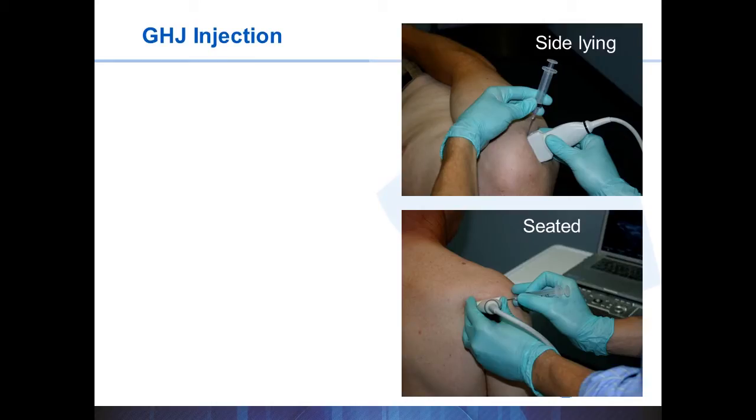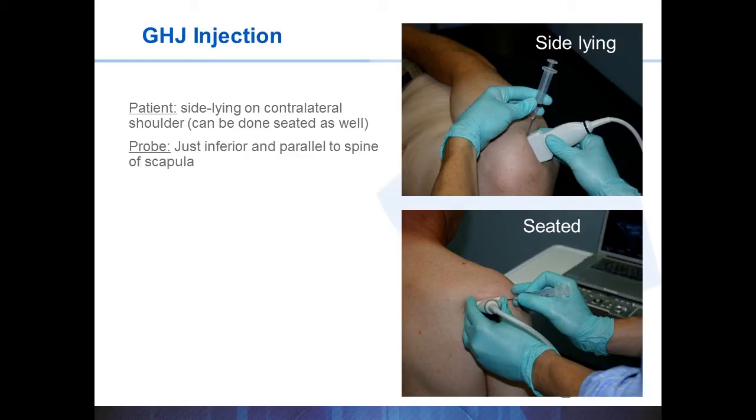I prefer to do all my injections with the patient lying down if possible. You don't always know who will get faint on you, and it's hard to decide whether to drop your needle or your expensive probe when trying to catch a falling patient. For the shoulder, I typically have them side-lying with the symptomatic shoulder up. The probe is placed just below the spine of the scapula, and you usually have to slide it slightly medial or lateral and tip the probe inferior or superior to get the image and details you desire.